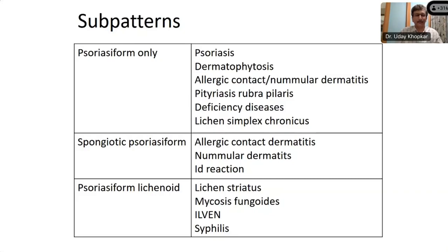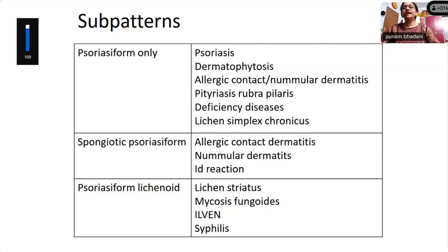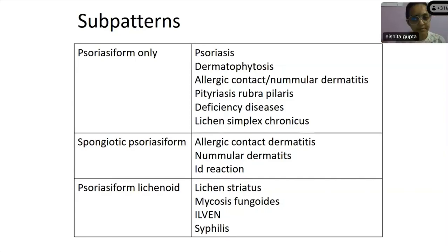Dr. Poonam, anything? Very nicely explained by Dr. Raj Lakshmi. One thing, because the first year PG students must know about the suprapapillary thinning, what different terminologies we are using. And she kept on asking what are the changes in the rete ridges. That is the fusion of two rete ridges. That is also, there is thickening of the rete ridges. So these are the few salient features with which they can go ahead with the diagnosis of psoriasis. I think that's all from my side. The basic things about psoriasis, nicely explained by Dr. Raj Lakshmi. Thank you.